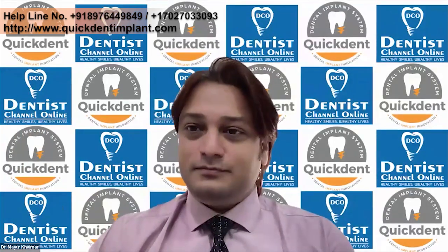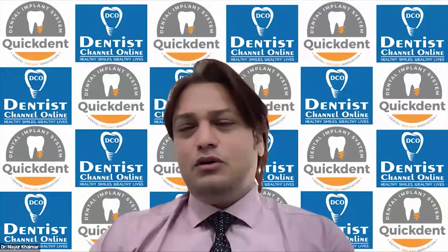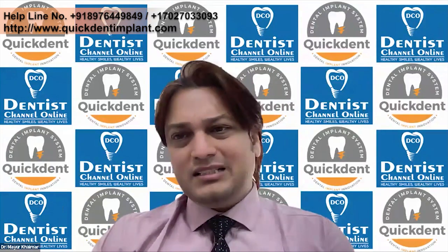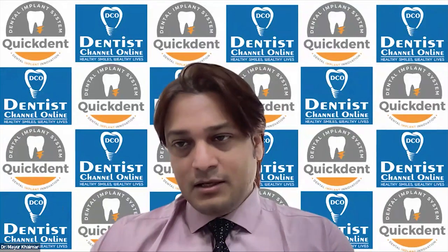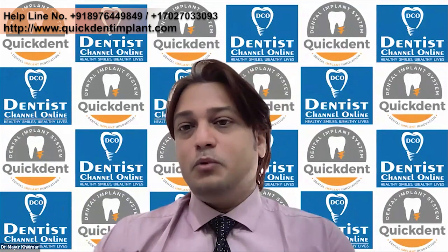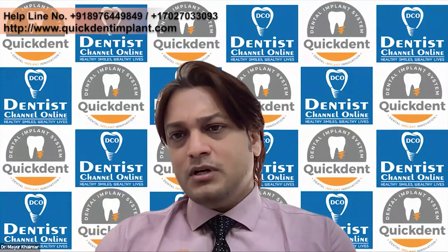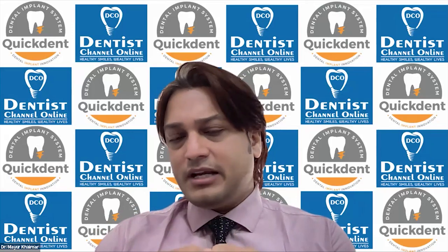Next question: how to choose between selecting OSSY or TPR at a particular site? As I've told, TPR is more commonly used for more resorbed cases, and where the bone is decent enough, you can go for OSSY. For single tooth restoration, especially molars, OSSY is the best. TPR is good for anterior sometimes, where there is bone deficiency. OSSY can also be used in the anterior, so no problem. Where the bone is absolutely healed and nice, I think OSSY is a very good option. There are a lot of people who love OSSY because of its active design. This is fantastic.